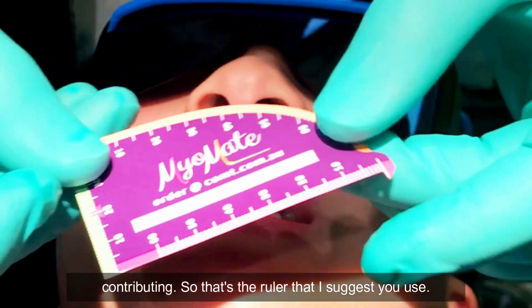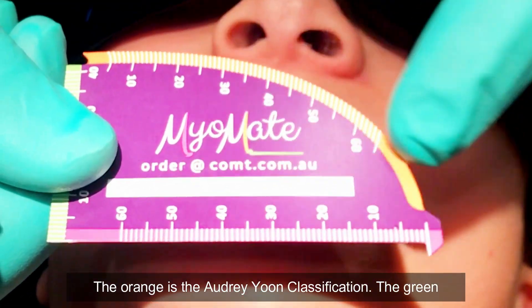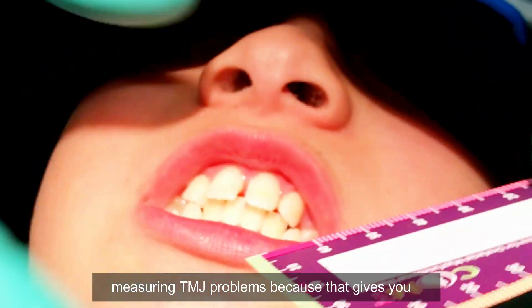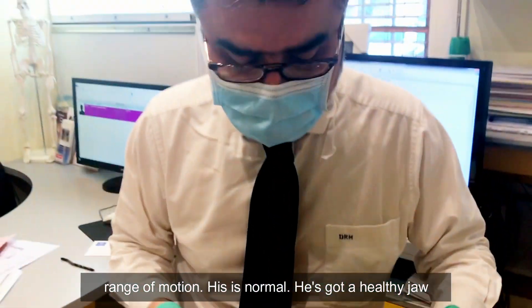That's the ruler I'd suggest you use. The orange is the Audrey Yoon classification and the green is for Kotlow. The benefit is you can also use this for measuring TMJ problems because it gives you range of motion. His is normal — he's got a healthy jaw joint.